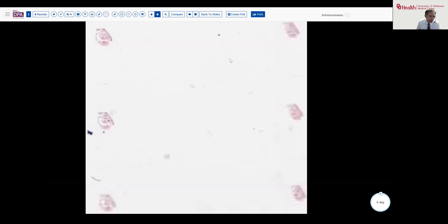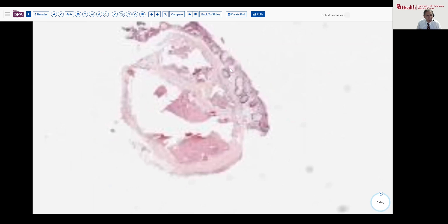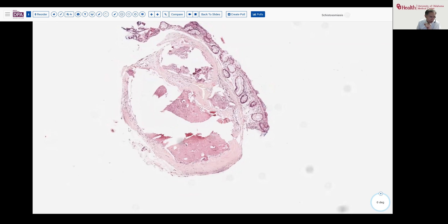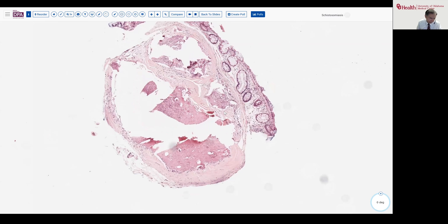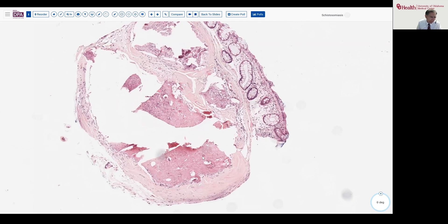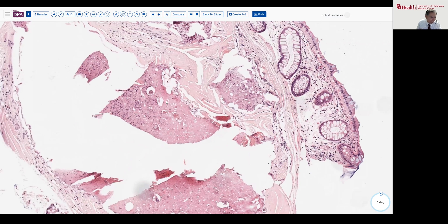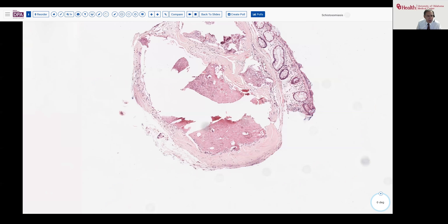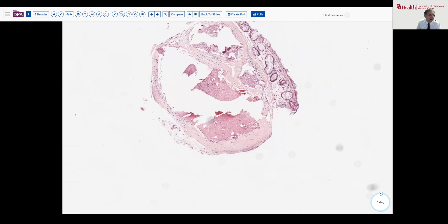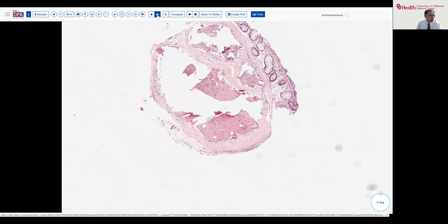The bladder is one location. Here are some samples taken endoscopically from a GI source — a colonic-type mucosa with a submucosal hyalinized granuloma with a little bit of necrotic debris. We have little egg-like structures entrapped in this granuloma. Not usually going to find the worms themselves here, but more likely the eggs, as this is one of the routes of exodus and shedding. The organism deposits eggs in the superficial vasculature or other locations in the colon, and through ulceration or other means, they exit the body to further the life cycle.